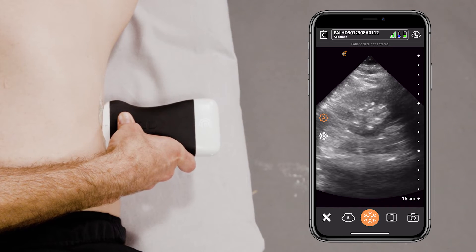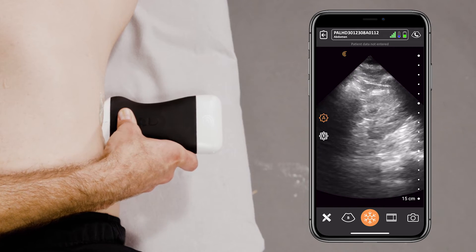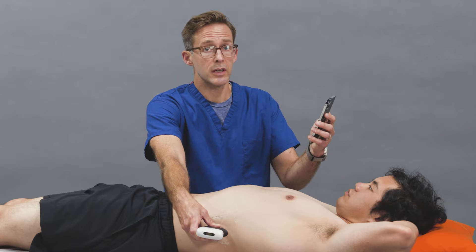That's what we're really looking for here. If it's really bad, it can almost look like a bear claw. So just scanning all the way through this kidney, we really don't see any hydronephrosis, which is good. I'll move on to the right kidney now.